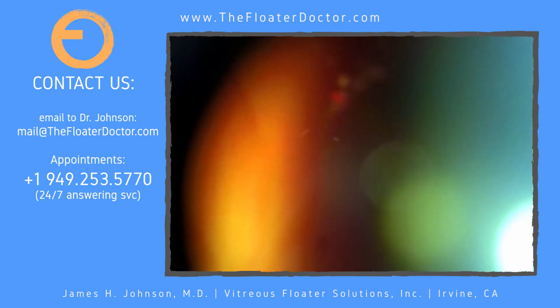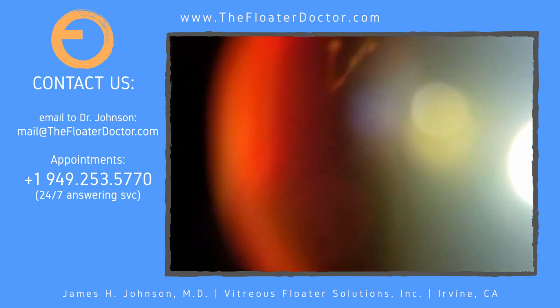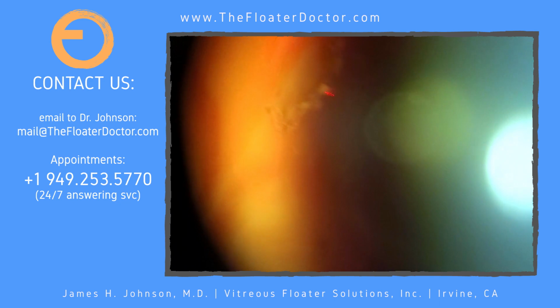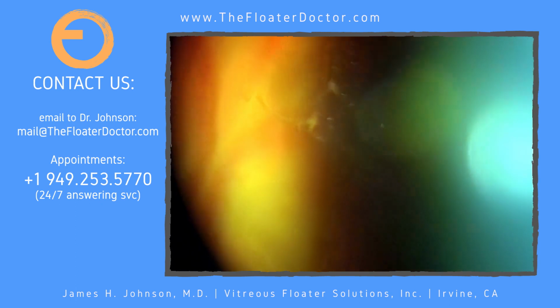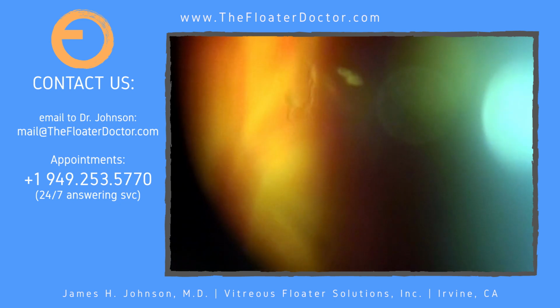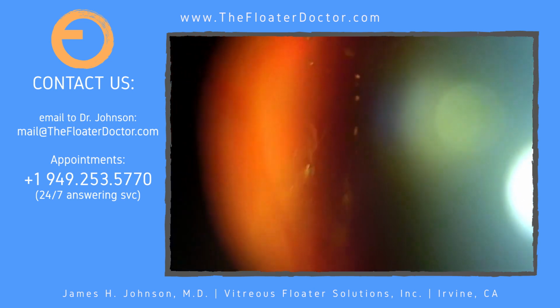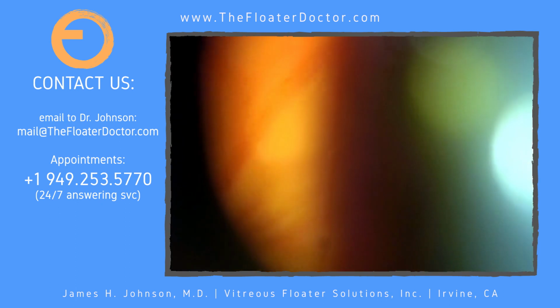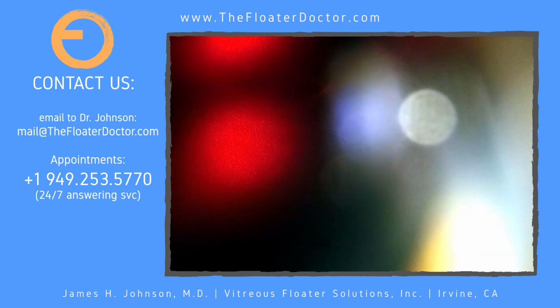Drop it down, make sure your mouth is closed, head forward, there you go, sink yourself down. Yeah, you're drifting up a little bit. Okay, right there. That's good. Okay, look down. This time way up high. Back down again.